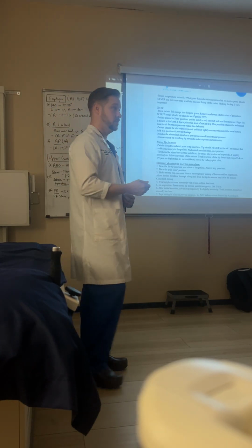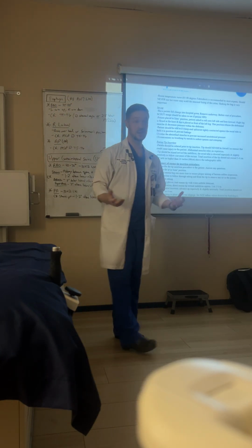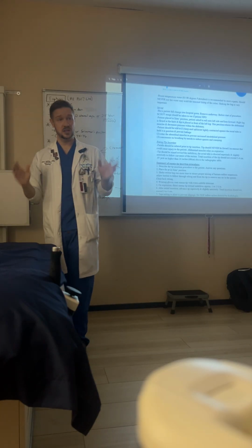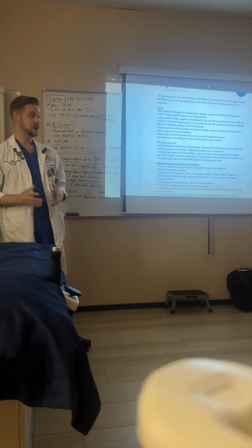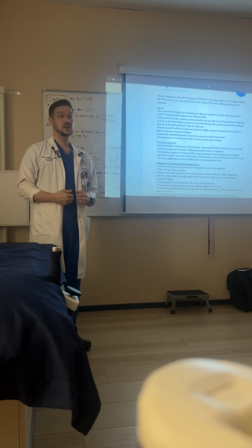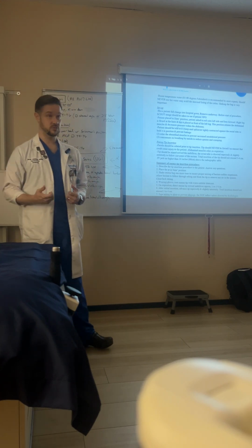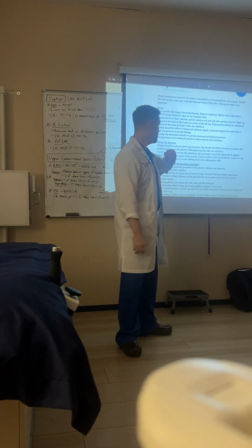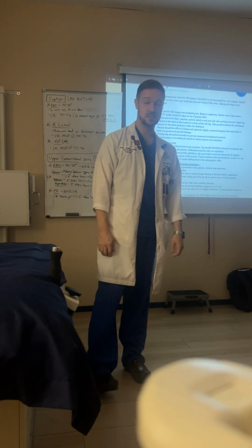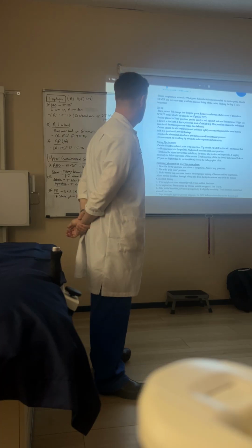Communication, patient comfort, okay? You're going to be fine. We're almost done. We're just getting a few more pictures. Just engage with them, try to keep them calm, because if they get anxious and they start tightening up, it's more uncomfortable, okay? So ask them to concentrate on breathing by mouth to reduce spasming and cramping, okay?